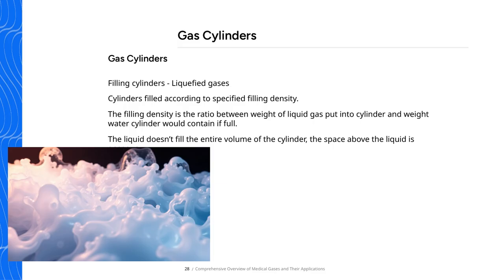Understanding this concept helps us ensure safety and efficiency when handling medical gases stored as liquids. It's a crucial part of managing these cylinders properly, ensuring they are filled correctly without risking overpressurization or other hazards. So, in essence, we're balancing the amount of liquid we put in with the space needed for the gas to vaporize, maintaining safe and effective storage.